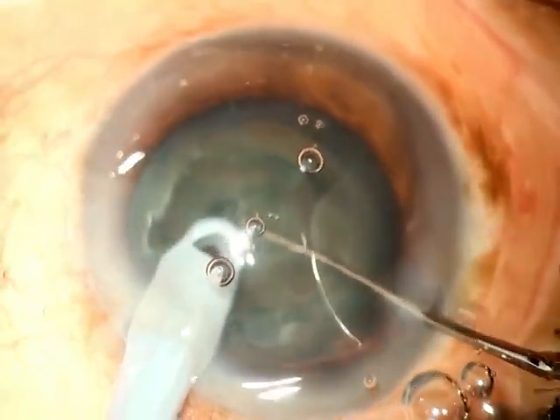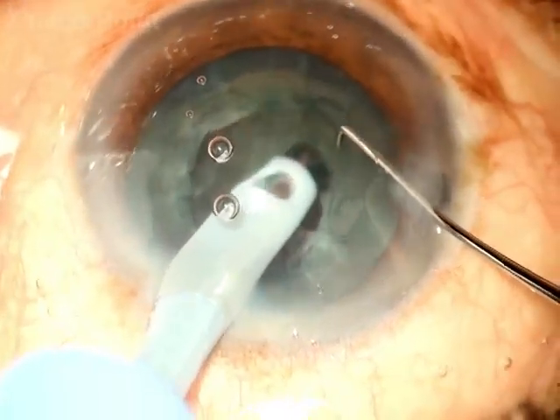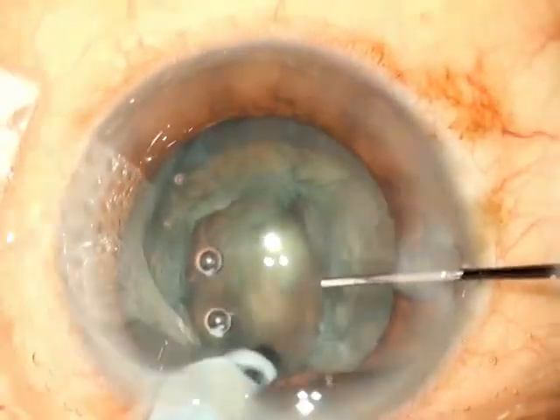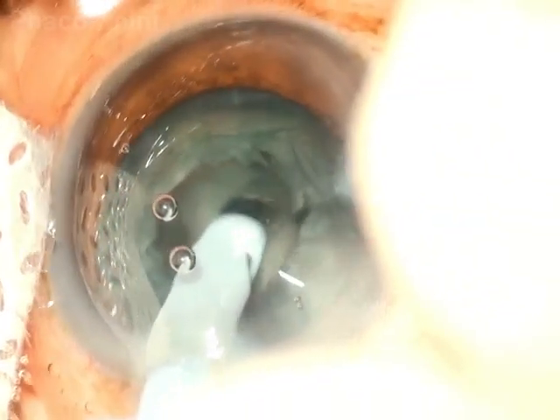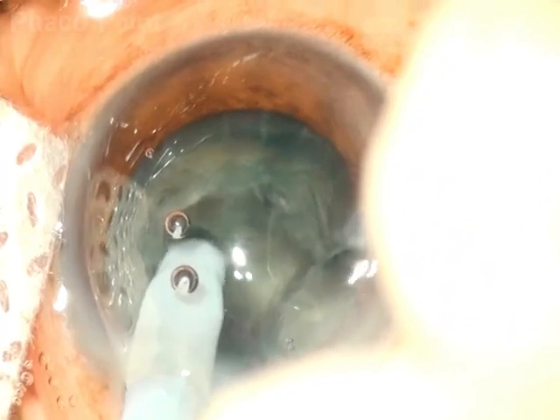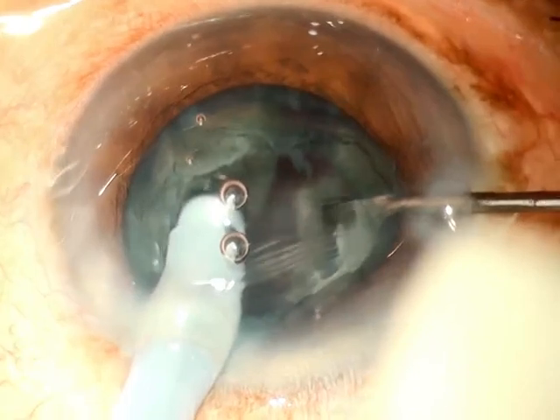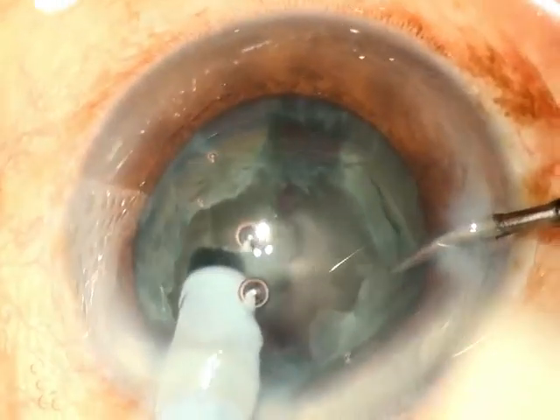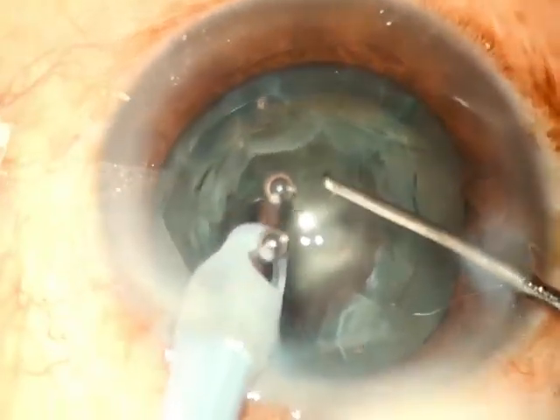Another option for dealing with a mechanical bowl when faced with one is to create a groove. The surgeon can go into the sculpt mode of the phaco emulsification and create a deeper groove in what's left at the bottom. In this manner, the surgeon may be able to mechanically subdivide the nucleus into two halves and complete a successful emulsification.